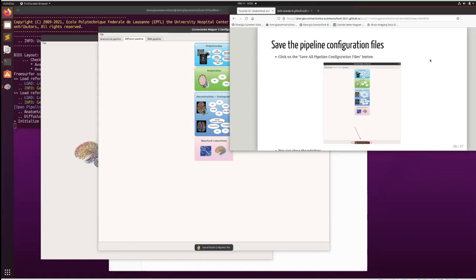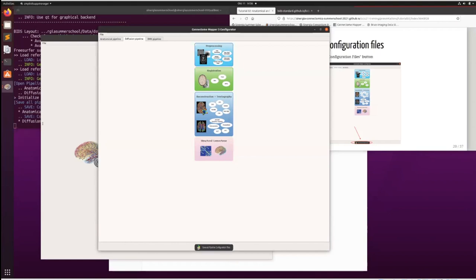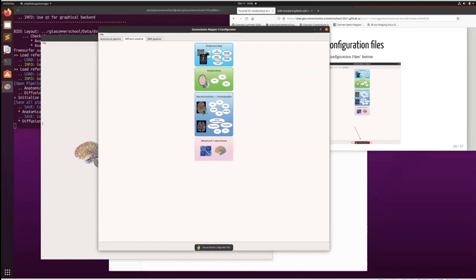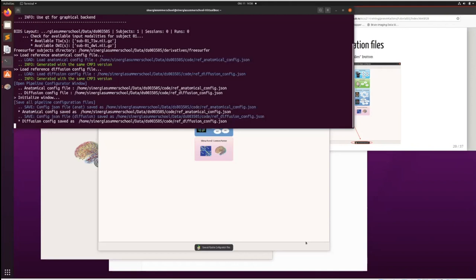Once all settings are configured, the last step is to click 'Save All Pipelines'. The interface saves the different configuration files with default names in the code folder of the BIDS dataset. The code folder is intended for files that generate derivatives or explain data manipulation. Now with the configuration file saved, you have two options: quit the GUI and run the BIDS app from the command line with Docker, or stay in the GUI and go to the BIDS app window.